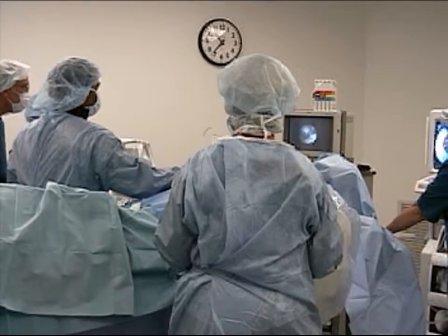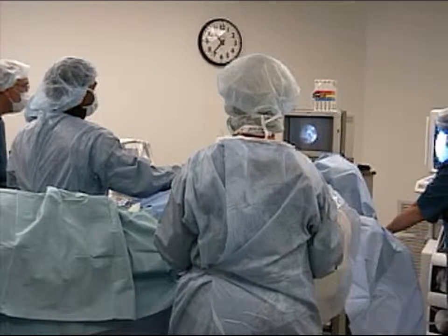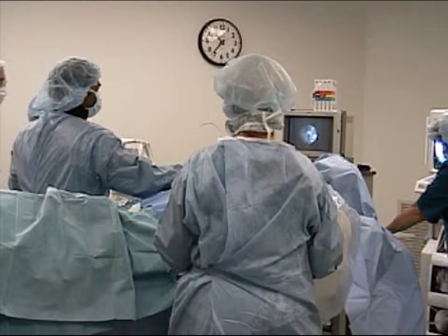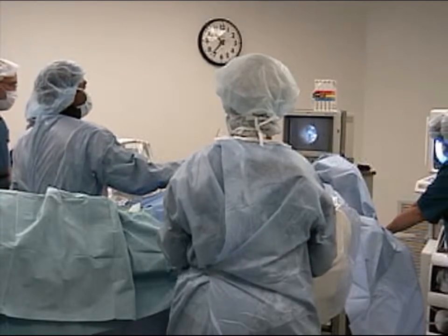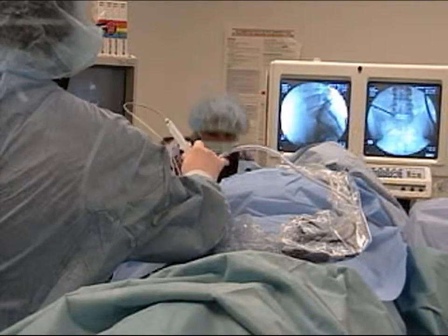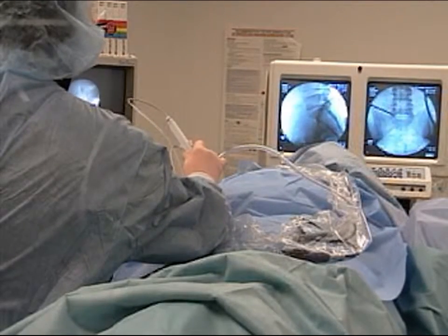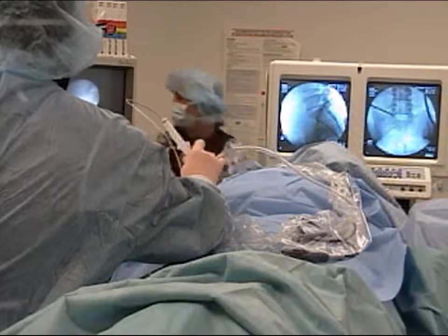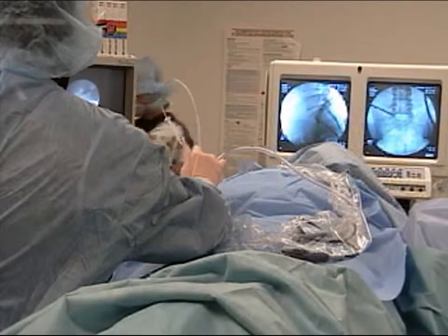LASE offers the advantages of minimally invasive therapy, including local anesthesia, limited length of stay, and minimal post-procedure pain. Most patients are discharged several hours after the procedure. Many experience significant pain relief during the procedure or shortly after, and the majority of patients who respond do so within one week.